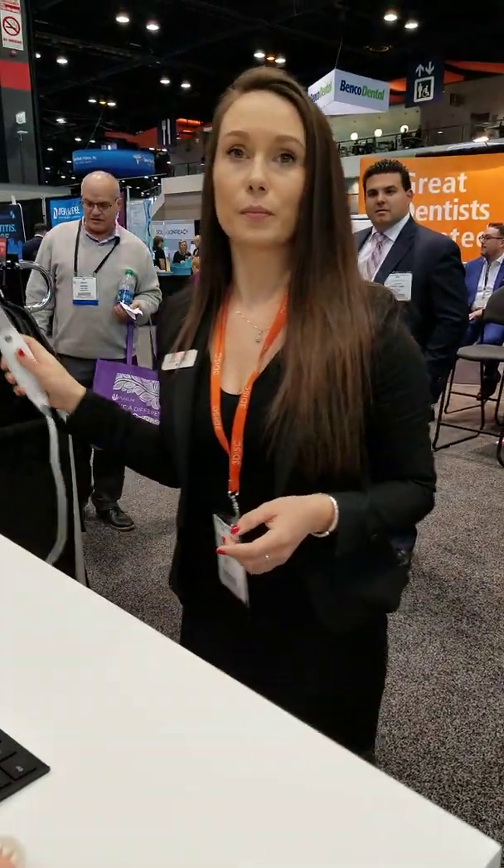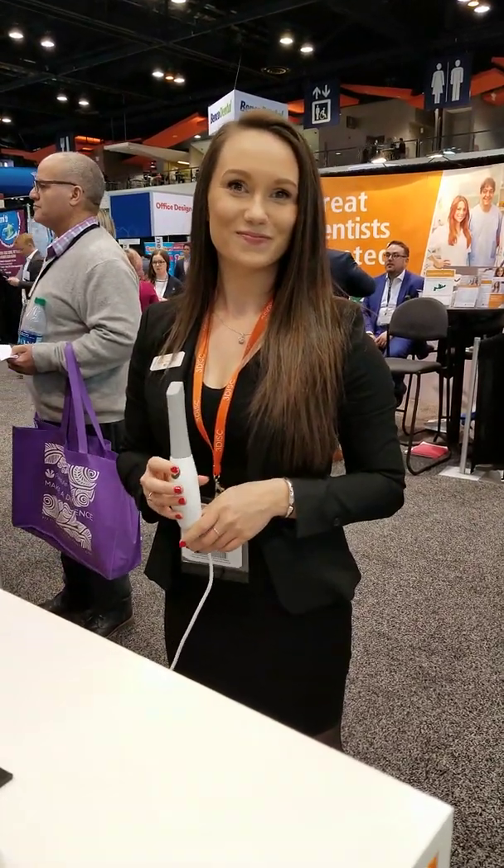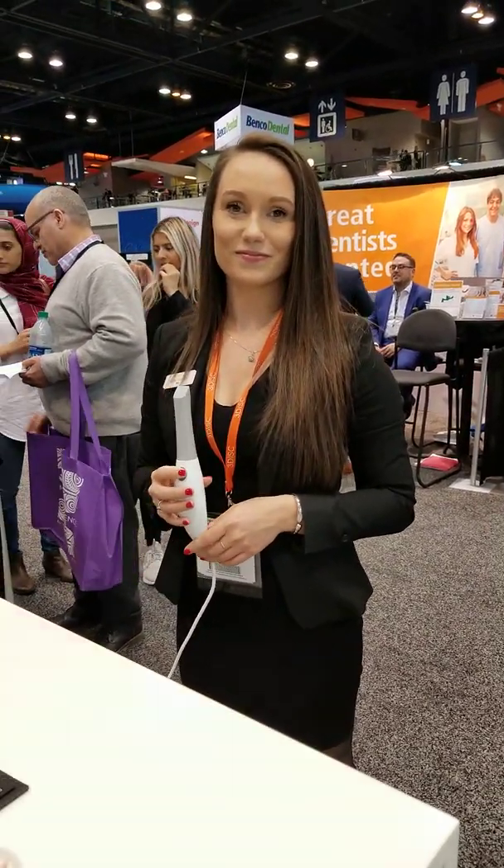Hey everyone, this is Dr. Amanda here with Straight Smile Solutions at Chicago Midwinter. Today we have Jennifer, she's here with Heron — an intraoral scanner owned by 3DISC. She's going to show you how quick and easy it is to scan with this solution.